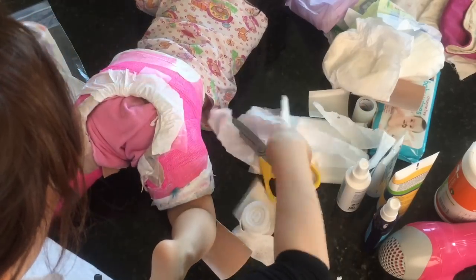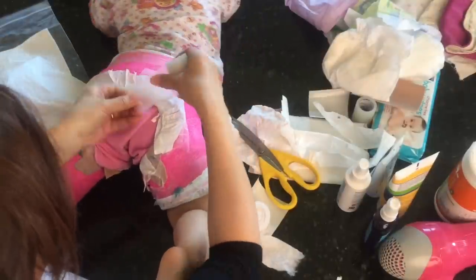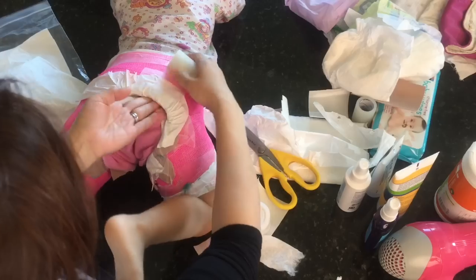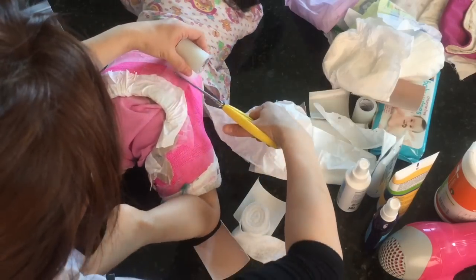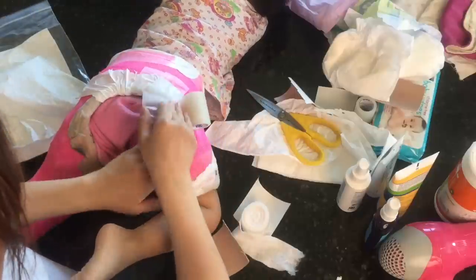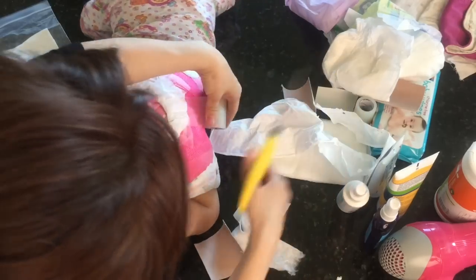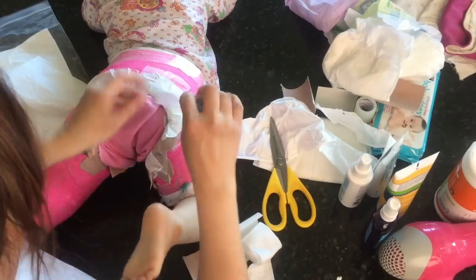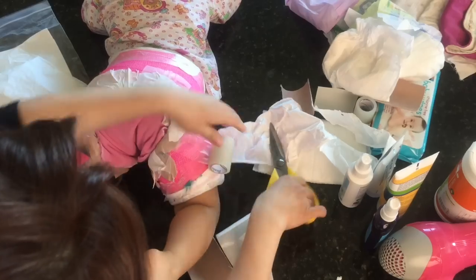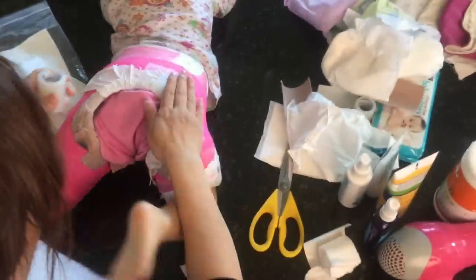The gore-tex material didn't stick well to the cast at first — it kept coming up, and when she napped and rubbed it off it would start leaking. But here's the solution: once you tape this properly, go as deep as possible and tape it really well. It takes time, yes, but for at least two to three weeks she won't have a smelly cast.